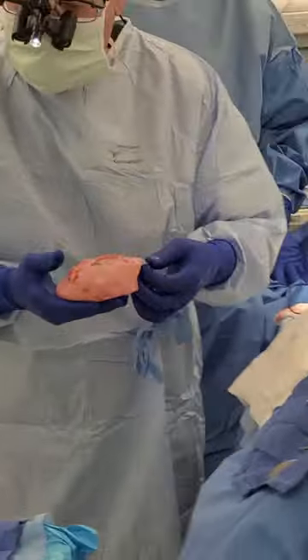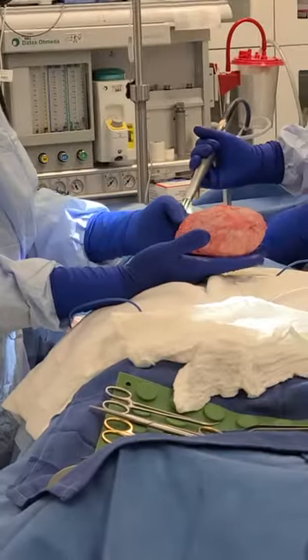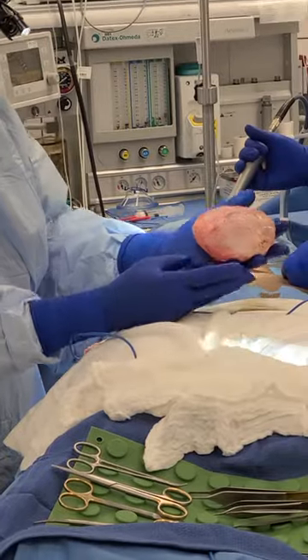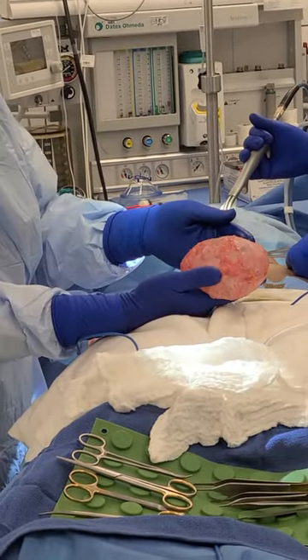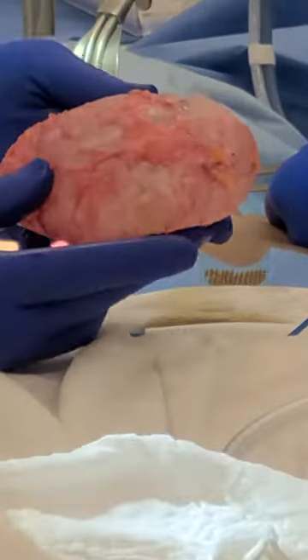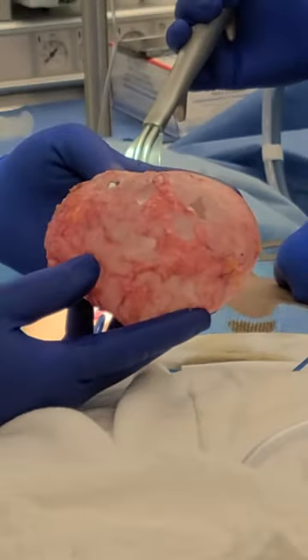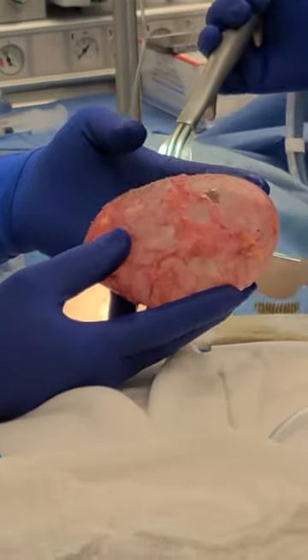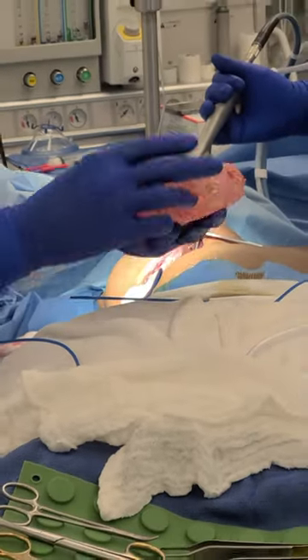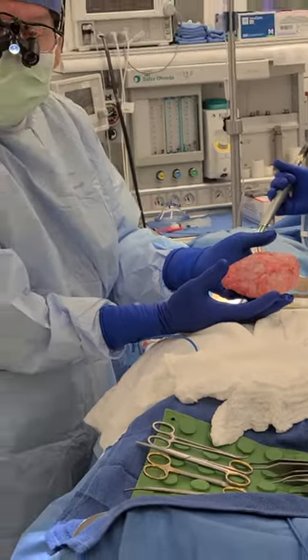What you can see now is that we've removed the implant as well as the entire capsule surrounding the implant. The capsule forms whenever you put a foreign body in any human being — your body's immune system reacts to it by forming a capsule around the foreign body.